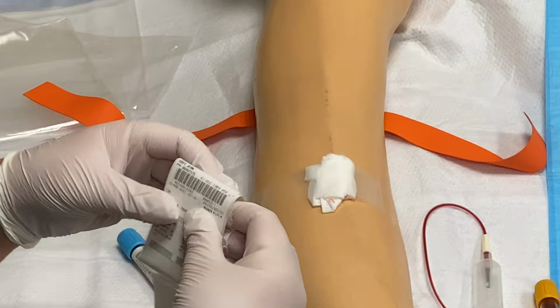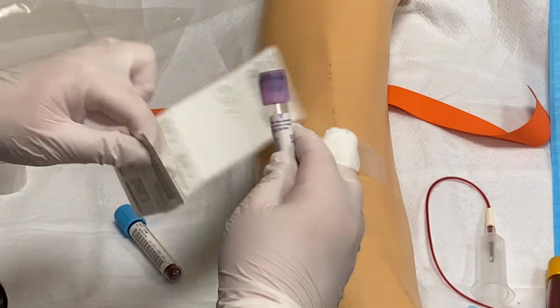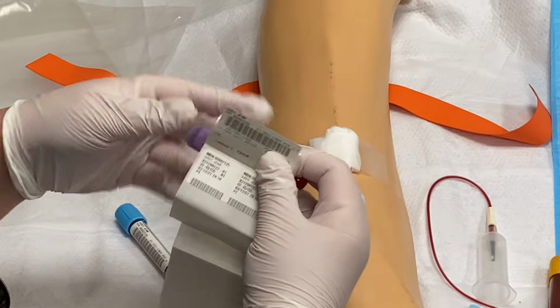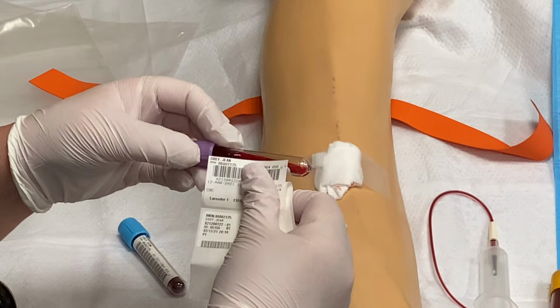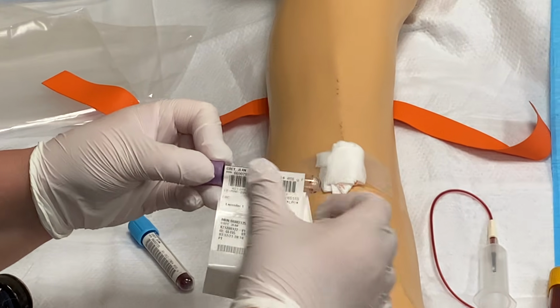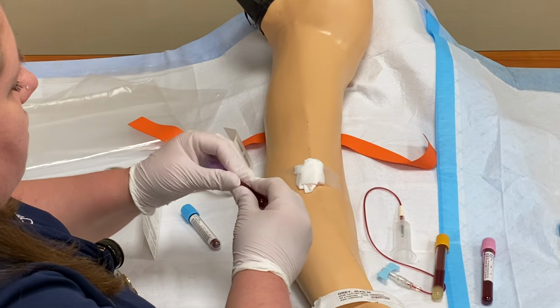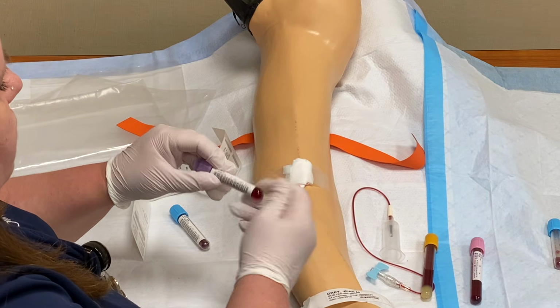Next I have lavender. So I'm going to grab my lavender tube. Again, this is a short tube, so I'm gonna put the label close to the colored top so the lab can read it easily. Cover the manufacturer's label. My lavender tube is ready to go.